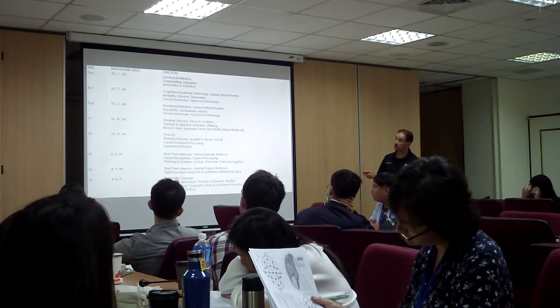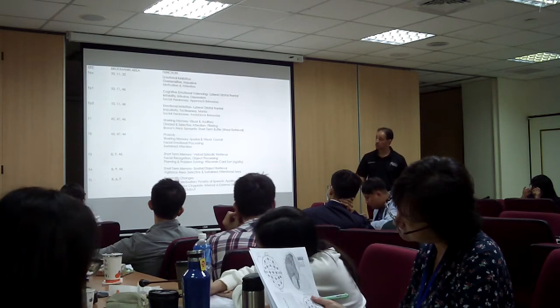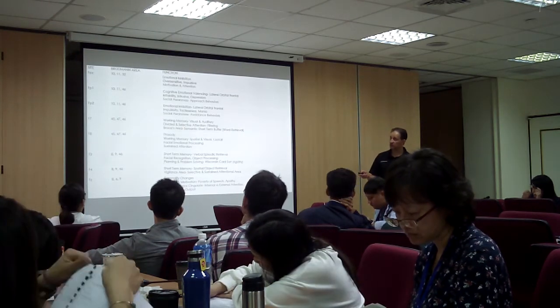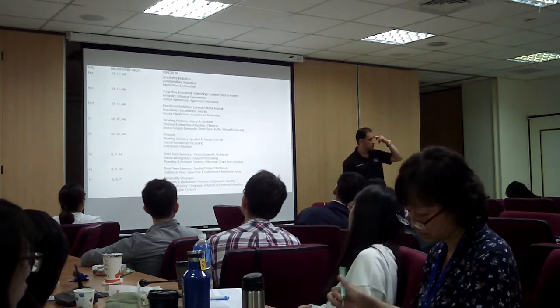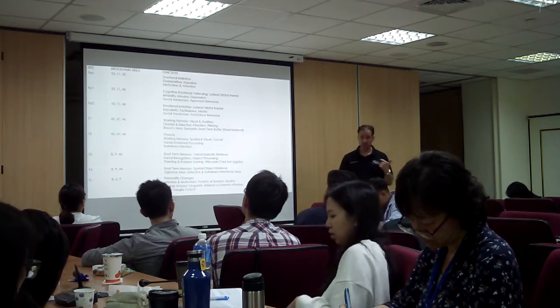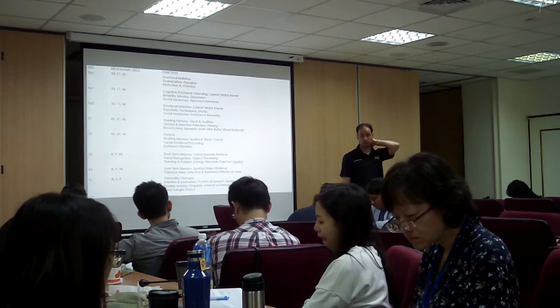Now, FP1 is a good protocol, and I'm going to tell you this. A lot of people don't use it, but I found it to be very effective. So if you train FP1 with eyes closed, it's good for sleep. I found it to be really useful for sleep.